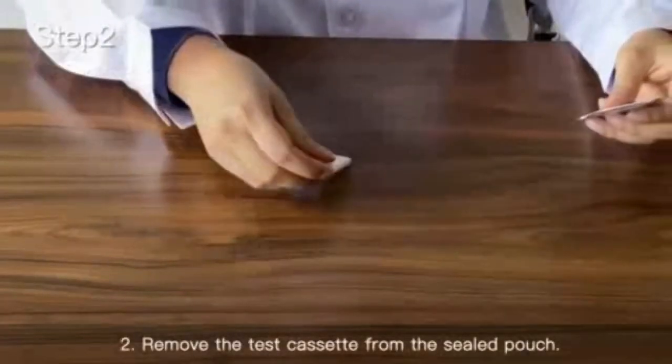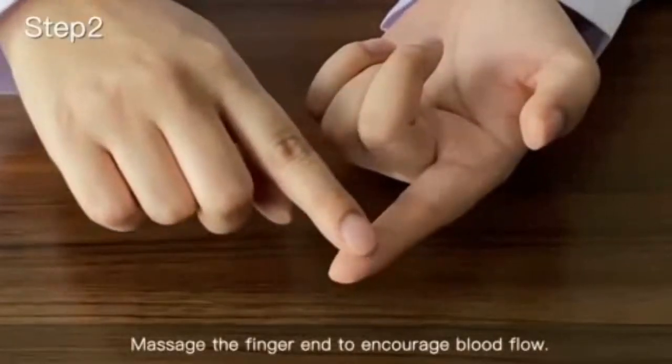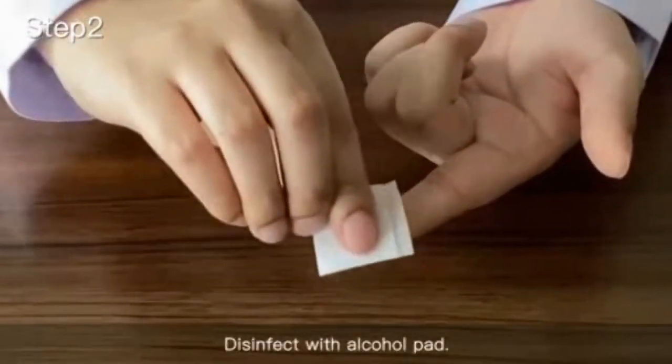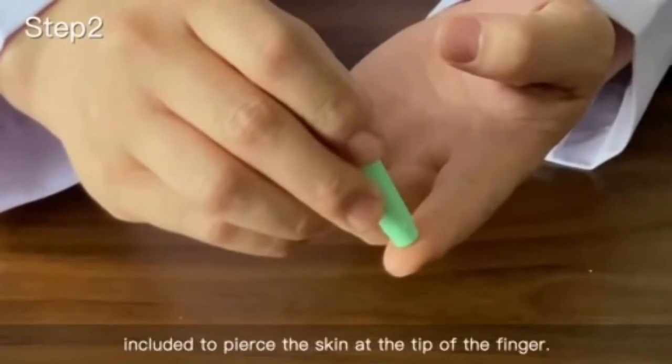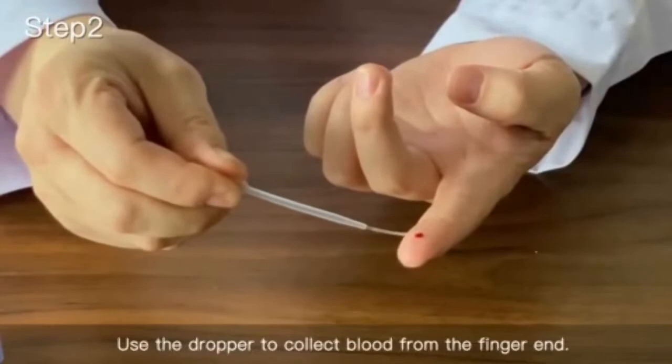Step 2: Remove the test cassette from the sealed pouch. Massage the finger end to encourage blood flow. Disinfect with the alcohol pad. Use the sampling needle included to pierce the skin at the tip of the finger. Use the dropper to collect blood from the finger end.